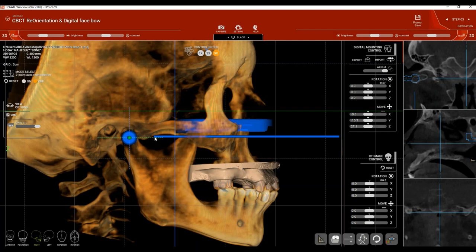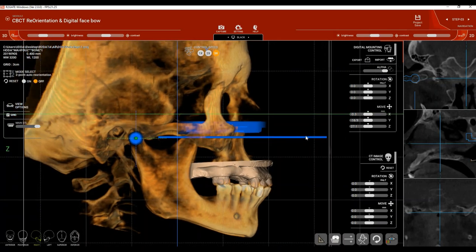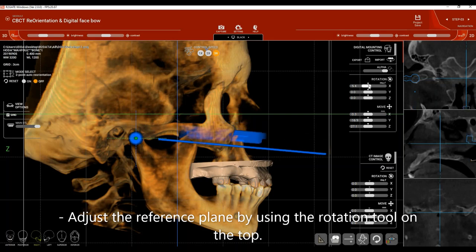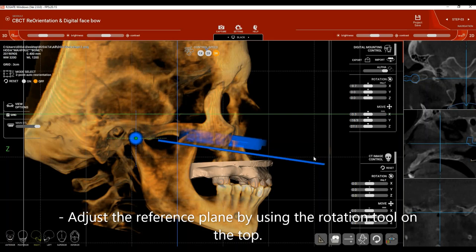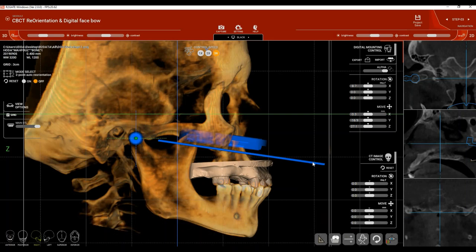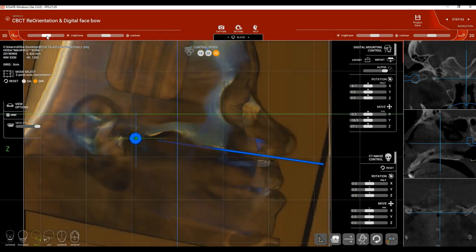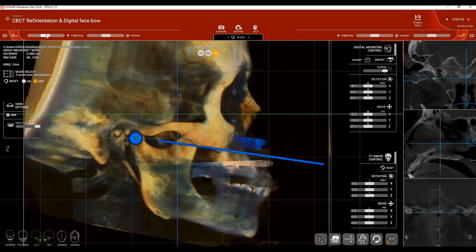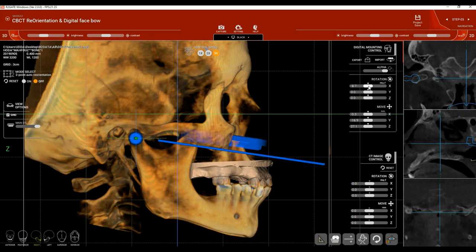The blue reference line is based on the articulator type being used. If you're using an articulator that references Frankfurt Horizontal Plane — like the Artics or BioArt Articulator — keep the reference plane as is. If you're using another type, like the CAVO Articulator that uses Camper's Line as a reference plane, adjust the line by clicking on Rotation and rotating it to be parallel to your articulator's reference plane. For Frankfurt Horizontal Plane-based articulators, keep the value at zero.